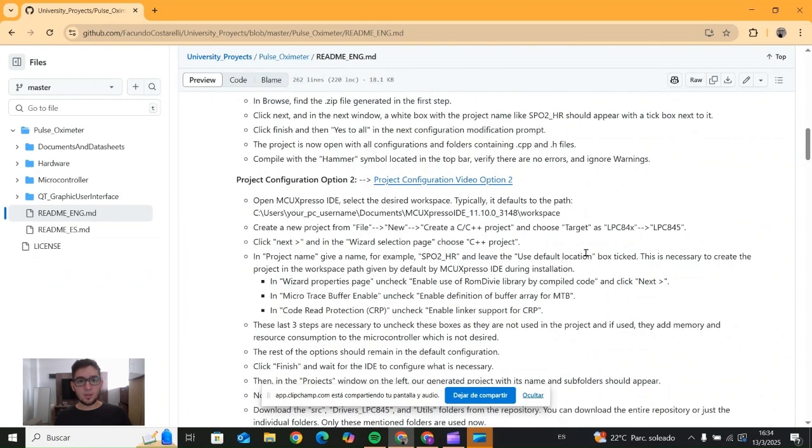The main idea with this different setup or configuration for any project is to do it in a different way. Typically, this would be the longest way to do this. However, you can have some benefits, like making all the configurations from the IDE from zero. You are not going to download any file or project with configurations previously done.